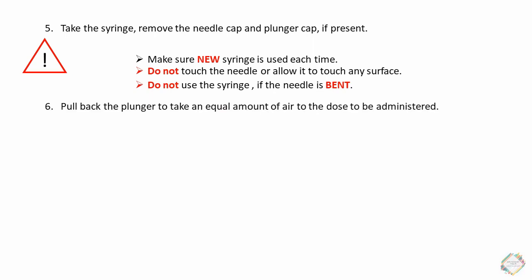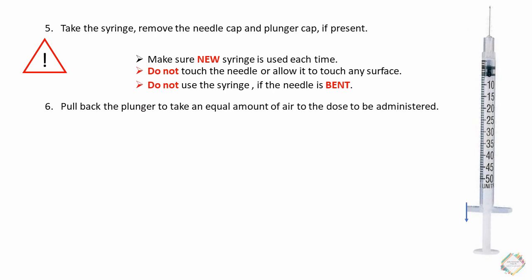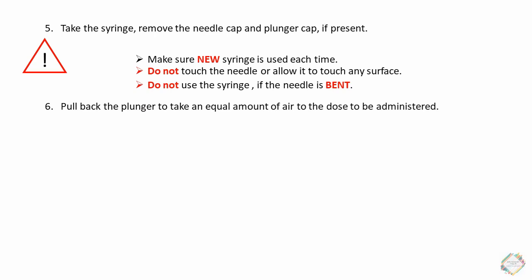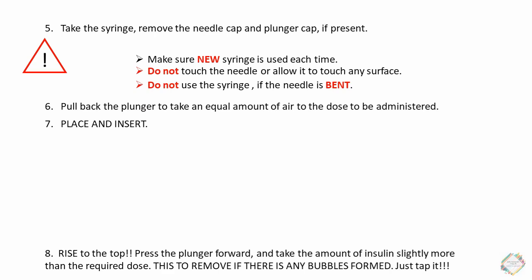Pull back the plunger to an equal amount of air as the dose to be administered — for example, if taking 15 units, pull back the plunger to approximately 15 units. Then place the vial on a flat surface and insert the syringe at 90 degrees with the plunger already pulled back. Rise to the top, press the plunger forward, and draw slightly more insulin than required, as bubbles may form. Tap to remove any bubbles and adjust to the correct dose.